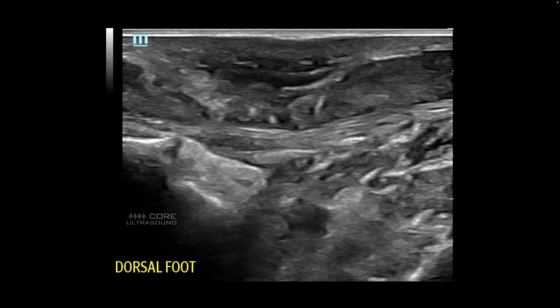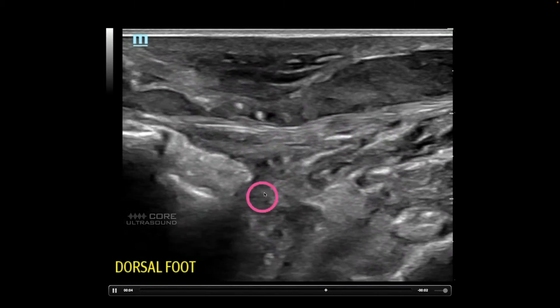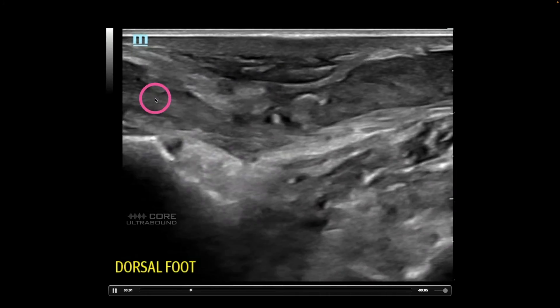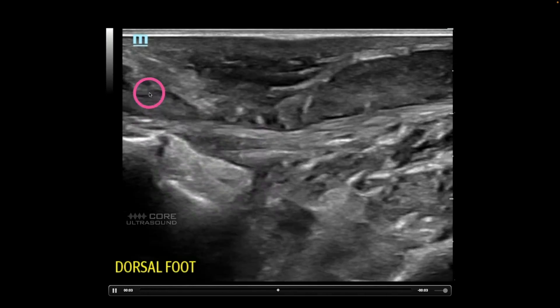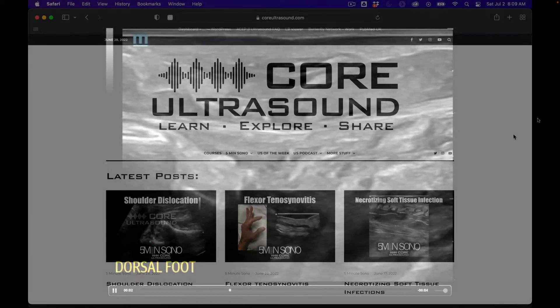This example is an infected effusion. This is the tibialis anterior tendon over here. You can see all that squishy pus, and you can even see it extending from superficial or outside of the joint into that joint. This was due to IV drug use.